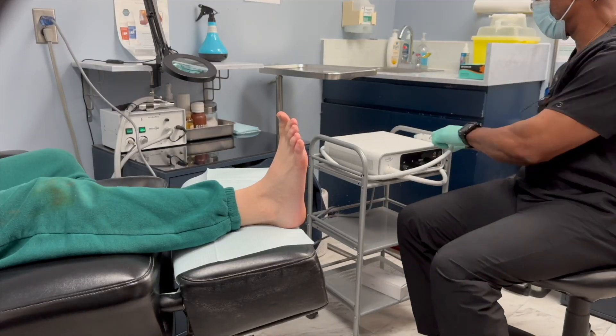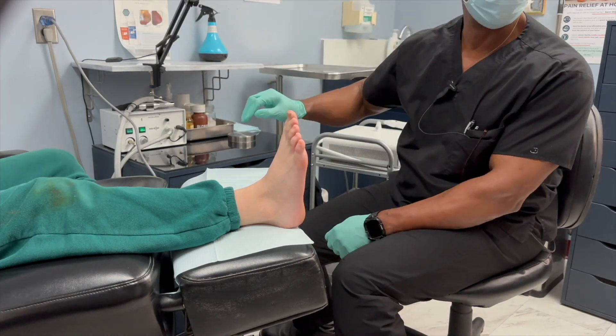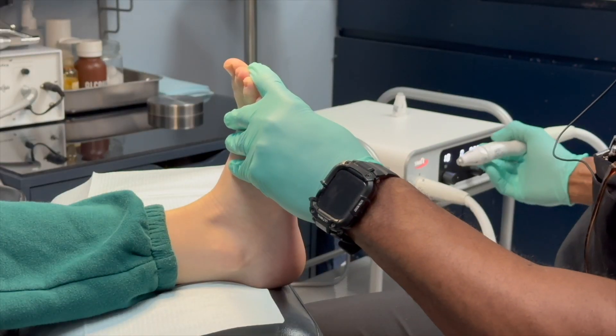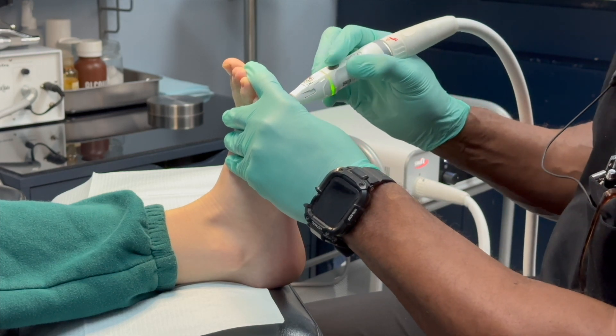The Swift delivers a precise dose of microwave energy directly into the affected tissue using a small pen-like applicator. This energy does not kill the wart, but rapidly heats the area, triggering your body's immune system to recognize and fight off the virus that causes the wart.